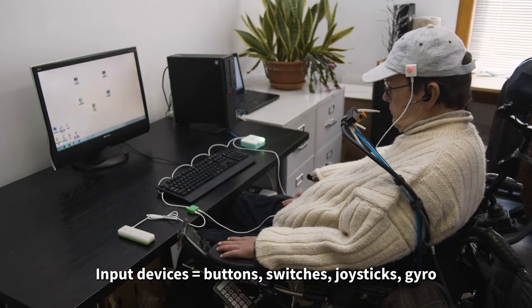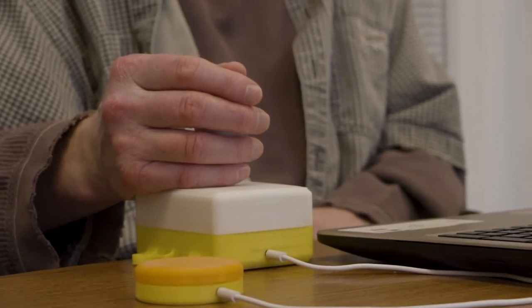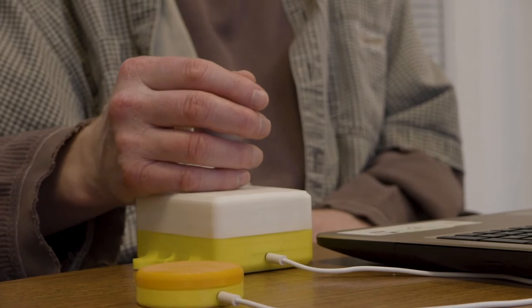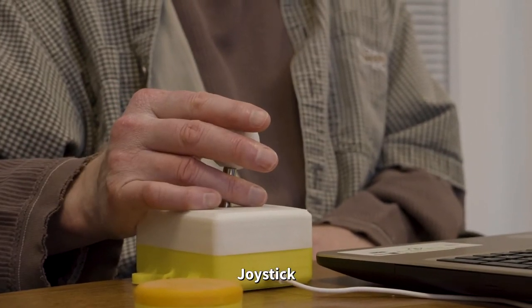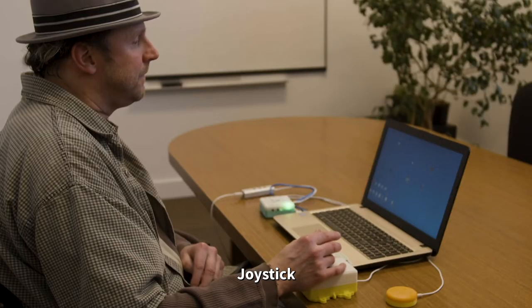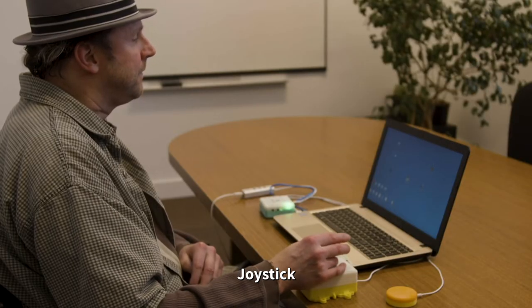In this video, we will introduce peripherals that might fit the needs of most users. We will be highlighting a joystick and button combination. The joystick functions as a mouse, moving the cursor up, down, left, and right. Let's see this in action.